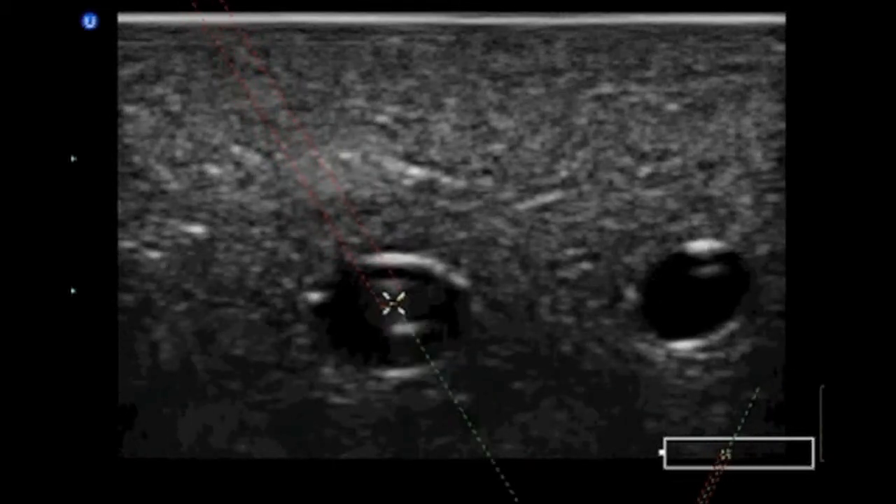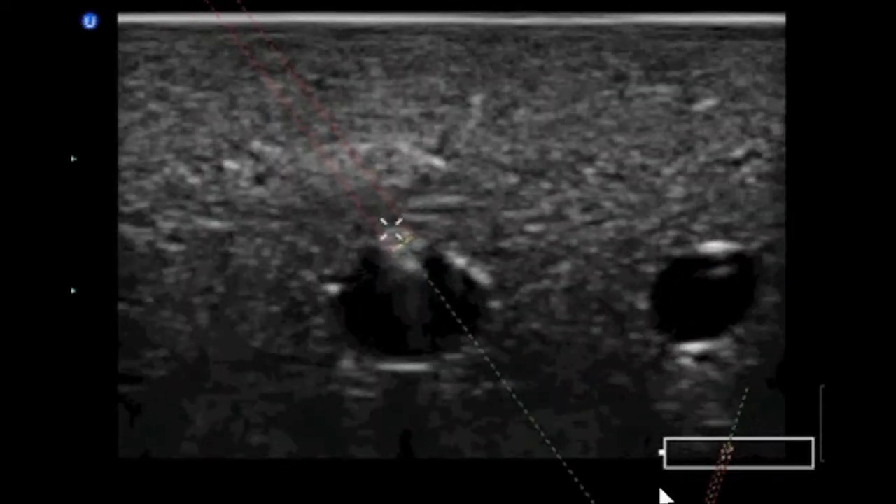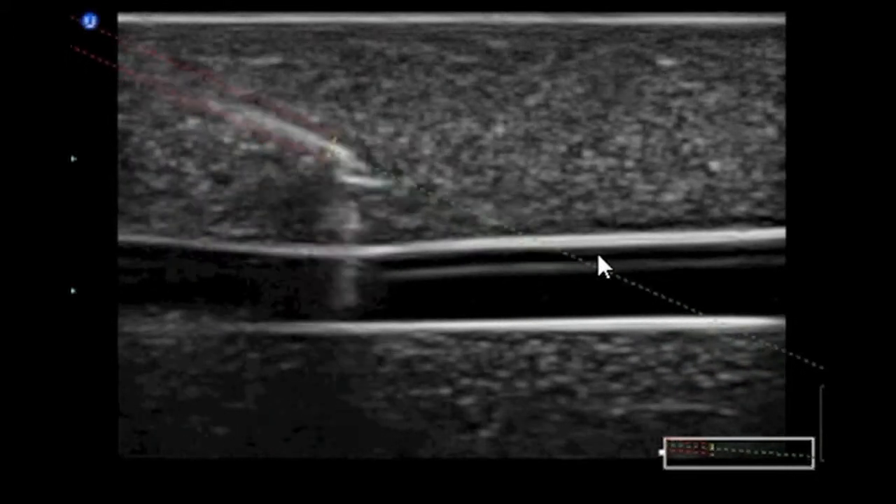As we go live, you can see the needle here, the distal tip there, and the laser pointer. We're going to go to an in-plane approach here, and we see the needle coming in following our laser pointer.